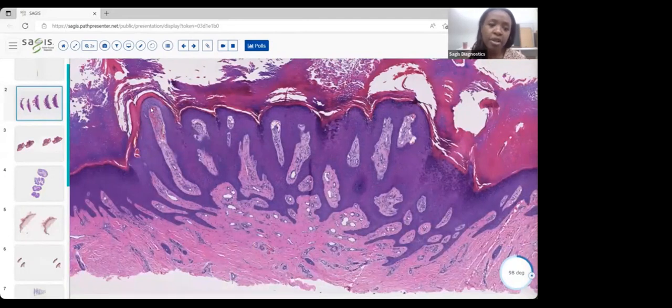And then I was earlier alluding to an architectural finding where we have this thin epidermis and the blood vessels really close to the surface of the lesion. As you know, warts can bleed so easily, and this is a simple architectural reason. Those blood vessels are really quite highly exposed there.